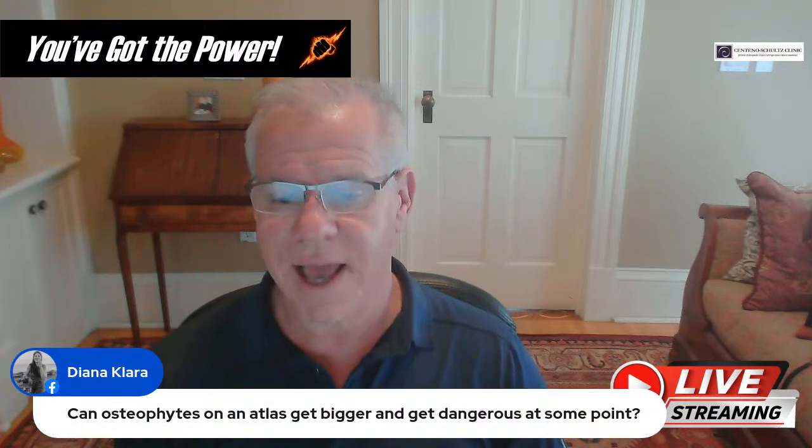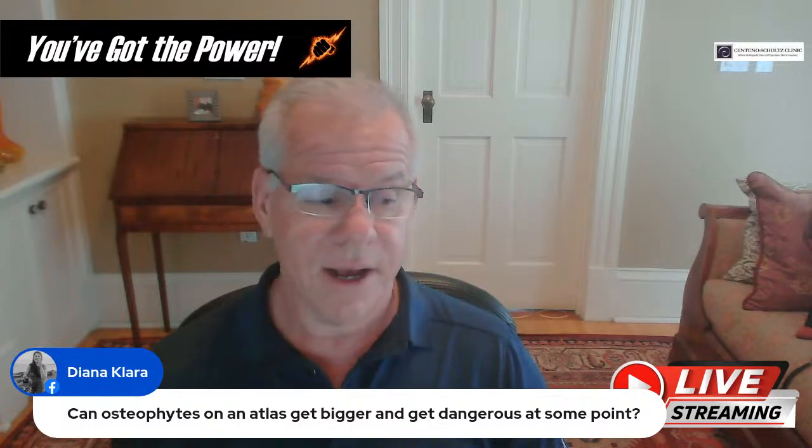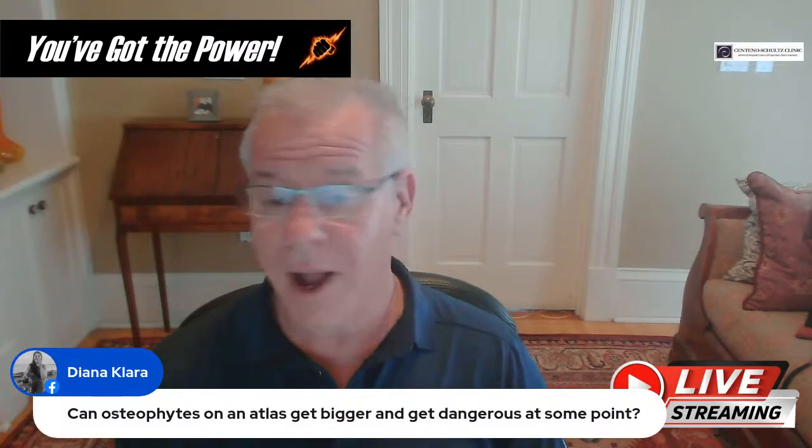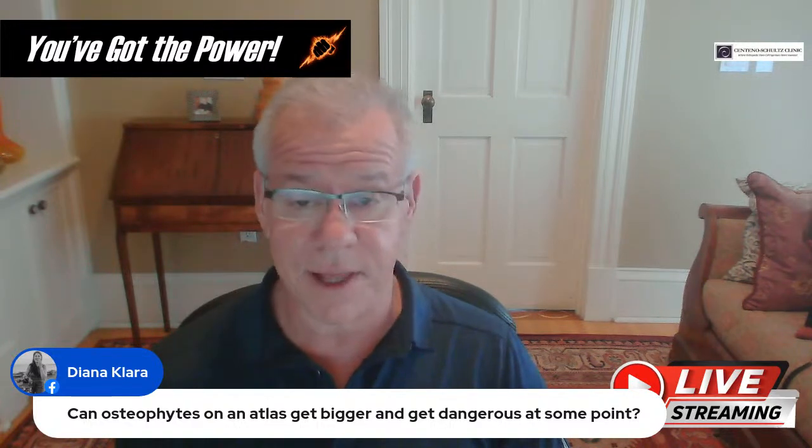Can osteophytes at the atlas get bigger and get dangerous at some point? I don't think dangerous. Realize your body is putting those osteophytes there to try to stabilize things. So they could theoretically cause some problems. Sometimes osteophytes do, but your body is doing that to try to stabilize things. So not dangerous. Any other questions, guys, that I can answer?